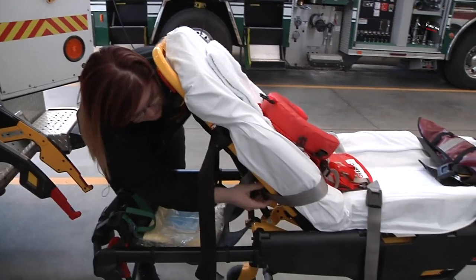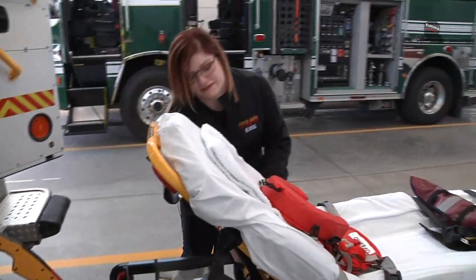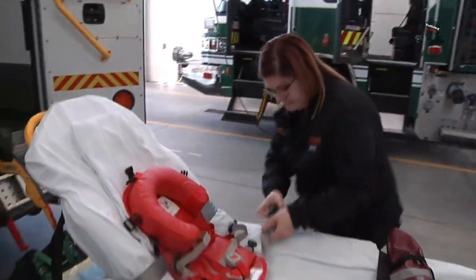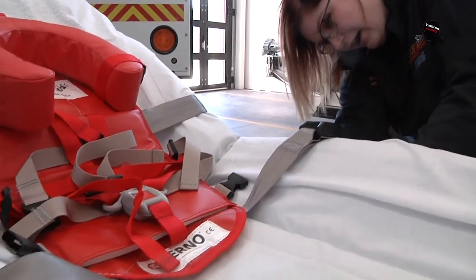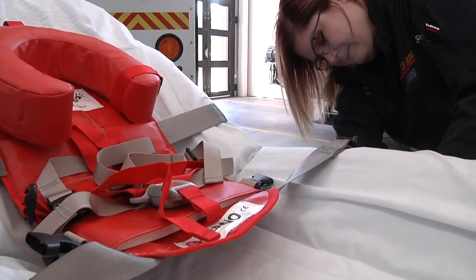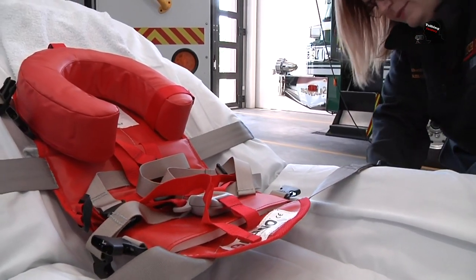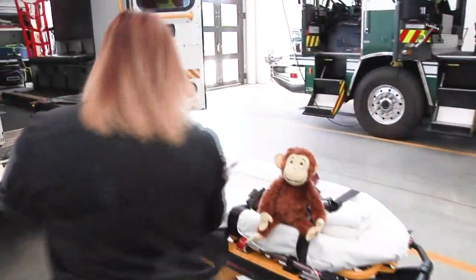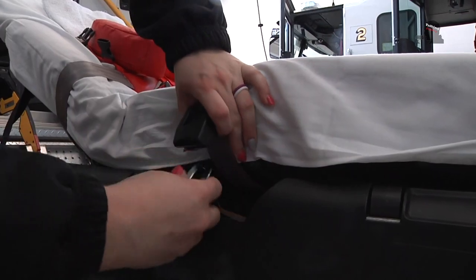And it's more secure than transporting the patient in their own car seat because we are able to make it snug, and it is built for this. Essentially built for this. So we do that. And then our other straps secure to a bar underneath the mattress. And with practice, this can be done, you know, fairly quickly and efficiently. So it buckles underneath where the mattress goes instead of to the arms of the cot itself.